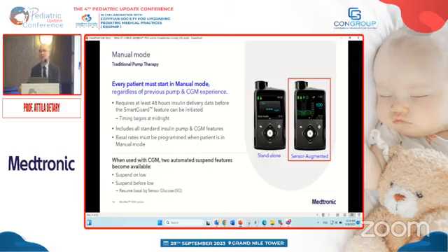Usually, when we transition a patient from multiple daily injections to insulin pump therapy, we reduce the total daily dose. You have the total daily dose on the injections. For example, let's take an adolescent. The total daily dose is 50 units. This is all the injections the patient applies during the day, roughly 50 units. And this should be reduced when the patient is transitioned to the insulin pump. There is a pumping protocol, so you can turn to us, to Medtronic, and we will share it. And this explains all the rules I'm talking about.